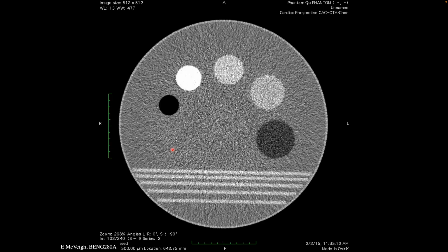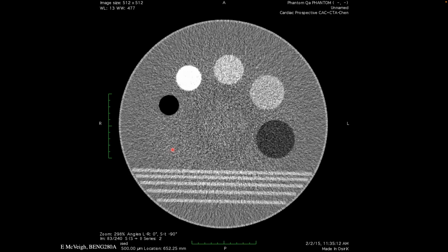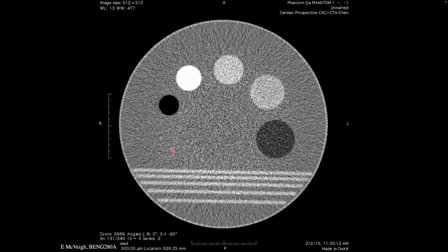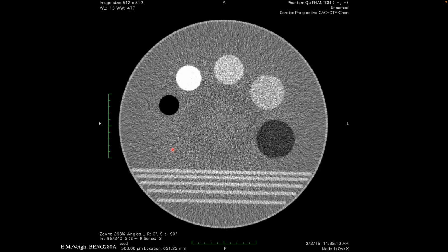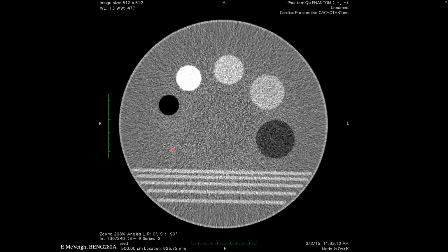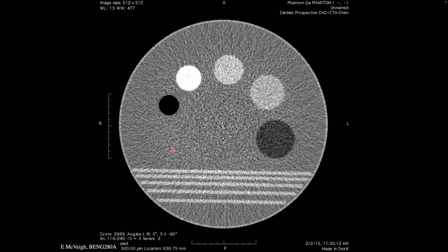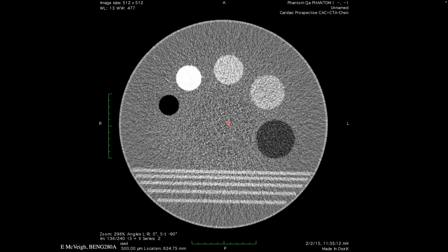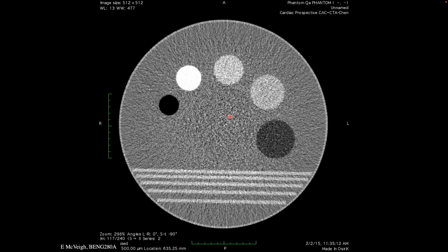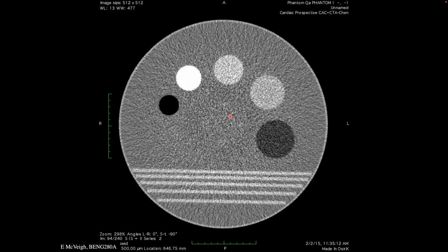I don't know if you can see this, but you can also appreciate the randomness or the level of noise by looking at different, independent instances of the image. So instead of just looking at how it changes in space, we can also ask, is the root mean square deviation in here the same as what I would get if I put a marker or a measurement on one pixel and took 100 images and then measured that standard deviation?